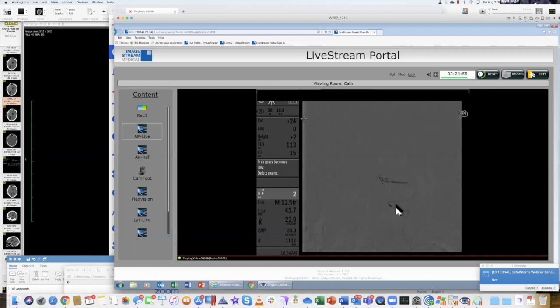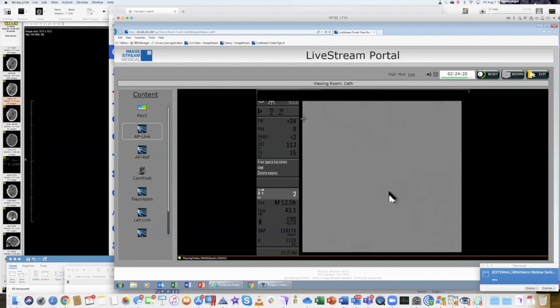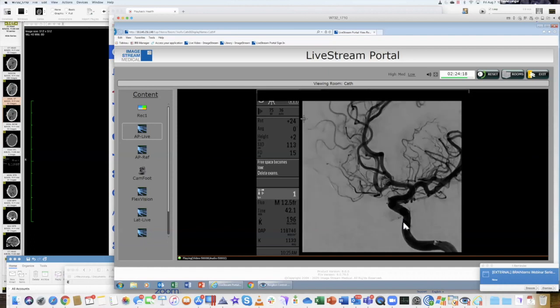I'll fix it. So here you go. She's putting this last coil in, and this is the marker again. Pushing, pushing, pushing. And now it's in. You said a little bit further. It's crossing the marker. That's good. Gonna do another run. See, the coil's really nicely filled. It looks great.